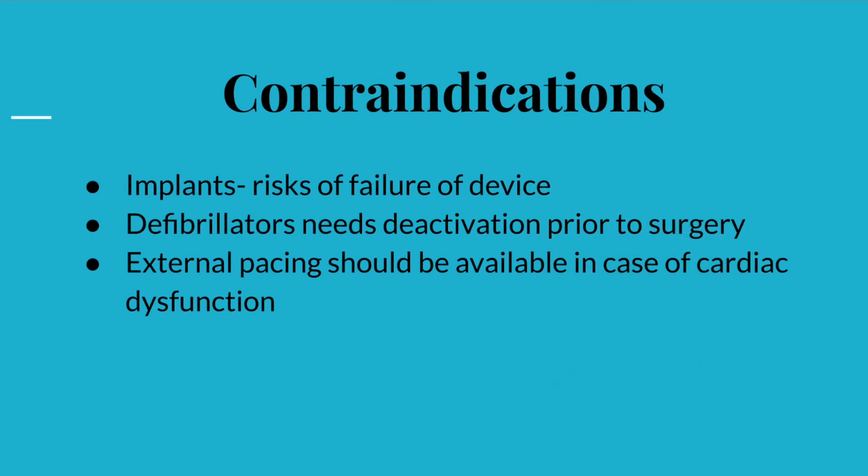Lastly, when is the time that we should not use a diathermy during surgery? One example would be where there is the presence of an implant such as an ICD device, which can cause a failure when it is not deactivated prior to the surgery. And this is the reason why external pacing should be available in case of cardiac dysfunction.